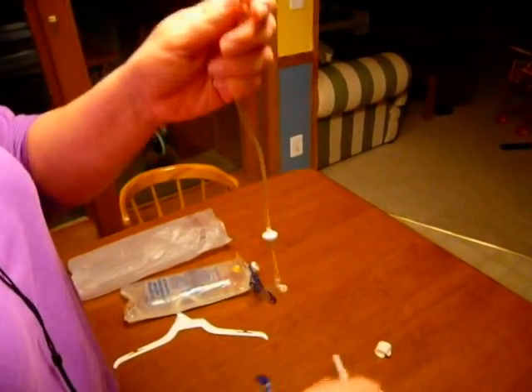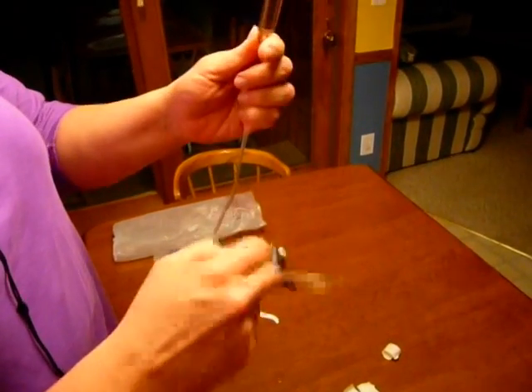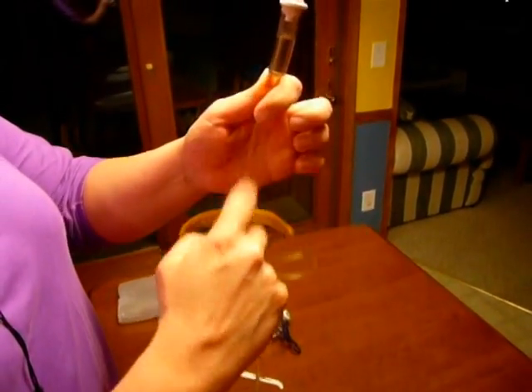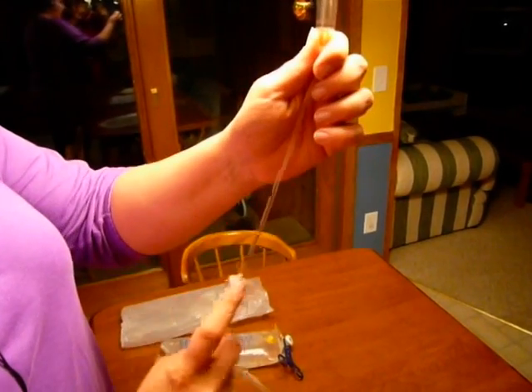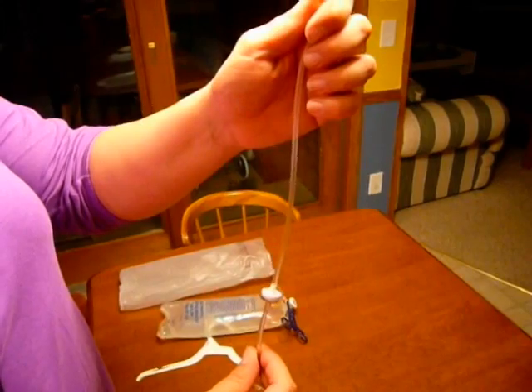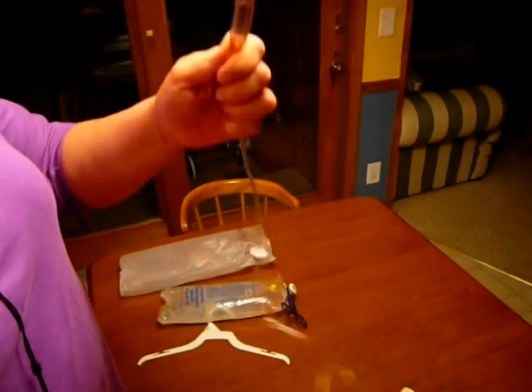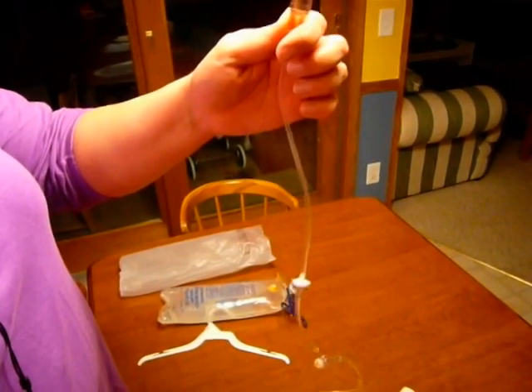So what I'm going to do is open up my roller clamp. But when you guys do this, you have to be careful that you don't allow the fluid column to get below the anti-reflux valve, which is right here. If you do, your tubing will airlock, and it'll be a lot harder to reset. So I'm going to make sure that the spike cover is loose.